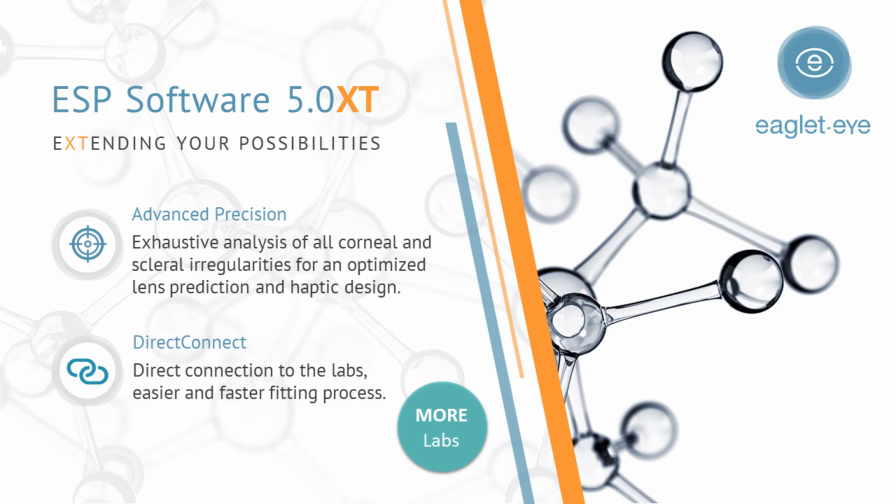The main star of today is the new software we're about to launch at the end of this month, and it's 5.0 XT. The main stars of this software update are advanced precision, and we'll dig in deeper during this presentation to clearly explain what it is, and we're extending the Direct Connect with more labs.